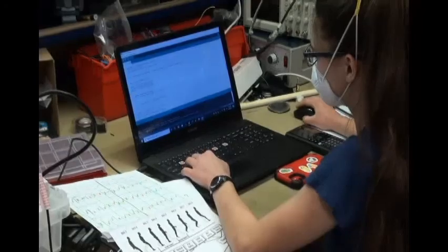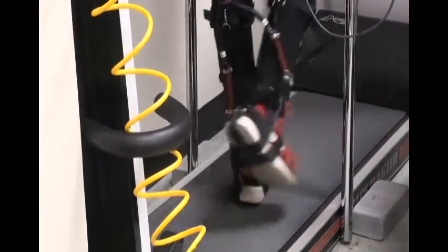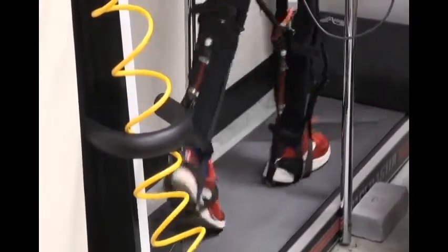muscles should be pulled. The other sensors that we're using for the rest of the exosuit are also FSR sensors, but they are placed between the attachment points of the hydra muscle and the hydra muscle itself. And so what that allows us to do is to be able to determine the length of the hydra muscle because the amount of force the hydra muscle is putting out is relative to its length.